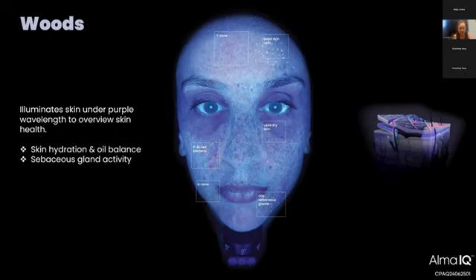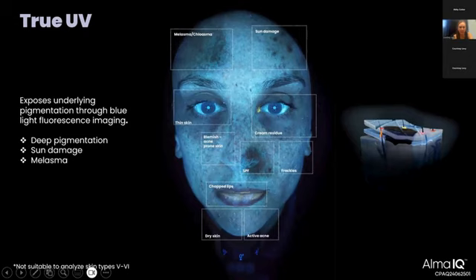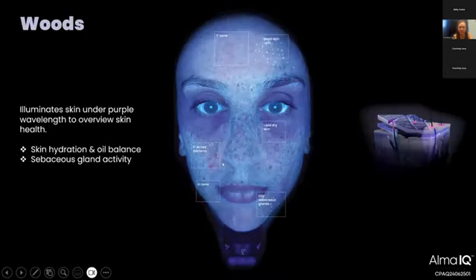And the reason for that is they will have all of these small dots that are orange. This indicates P. acnes bacteria, and these small dots will indicate oily sebaceous gland. So someone that has a very oily T-zone or has a lot of acne will have lots of bright colors on their face, which shows they have a lot of activity in their sebaceous glands.